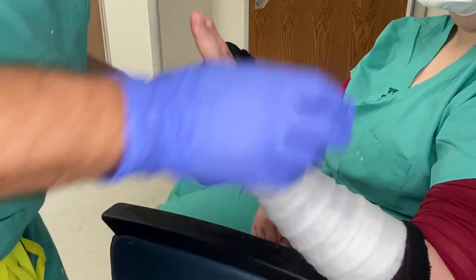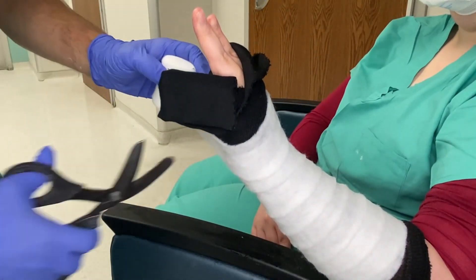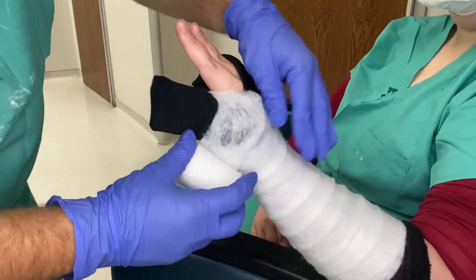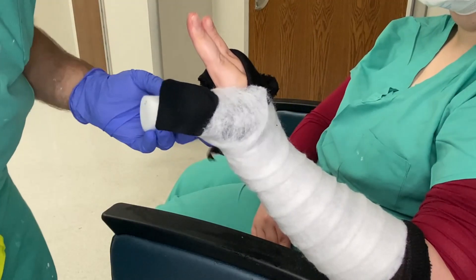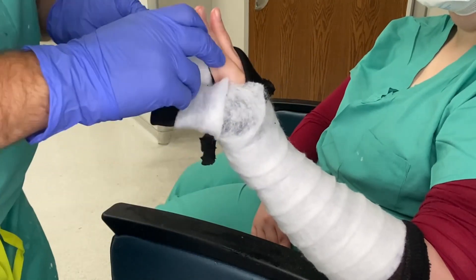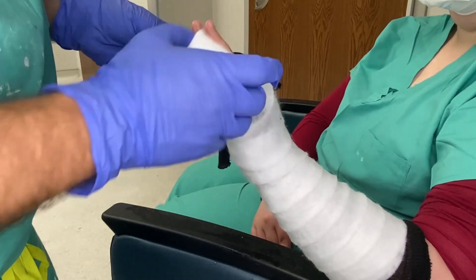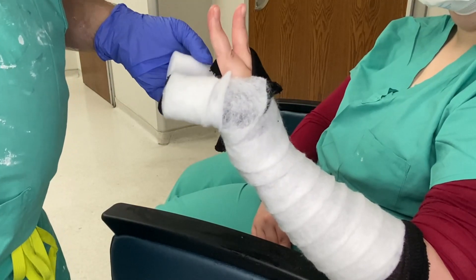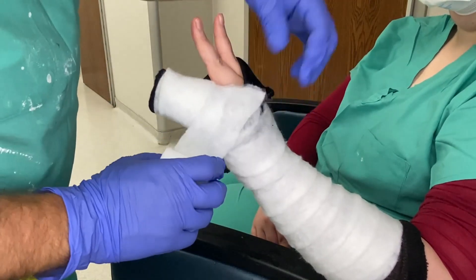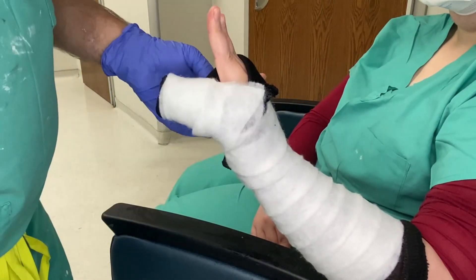For the ulnar gutter you don't have to worry much about the MP joint — just come around the thumb once, then do a three-quarters cut so it lays nicely. Then do a half cut and go around the fourth and fifth digit fingers three times, giving you three layers. Come back down and do another three-quarters cut just as you would when rolling a splint, getting a good two or three layers.